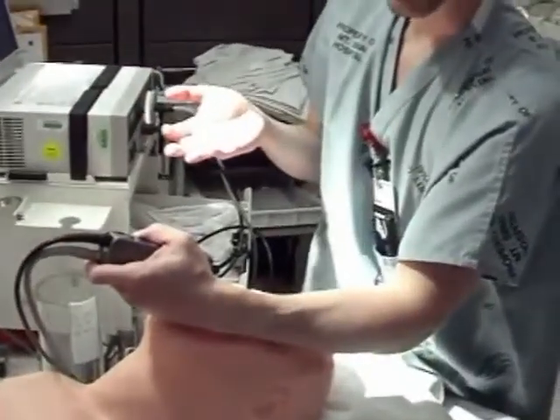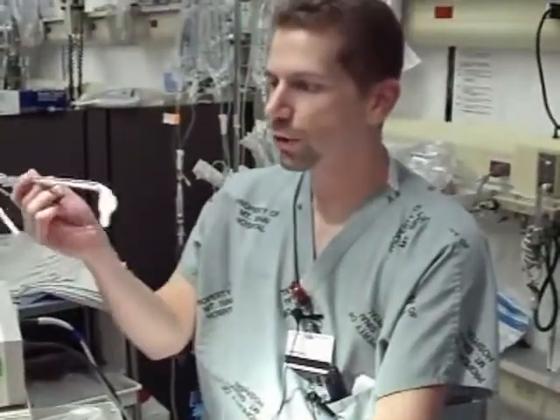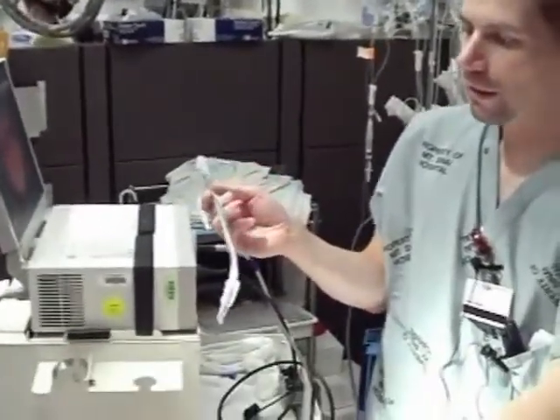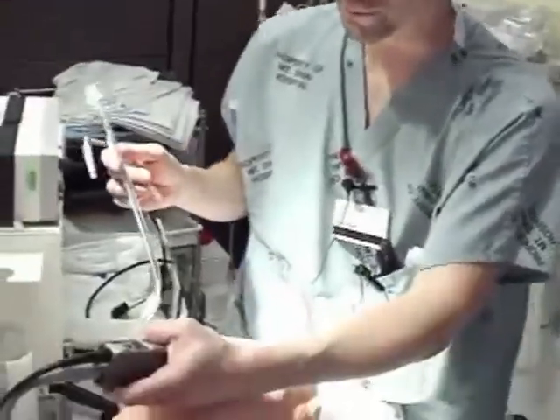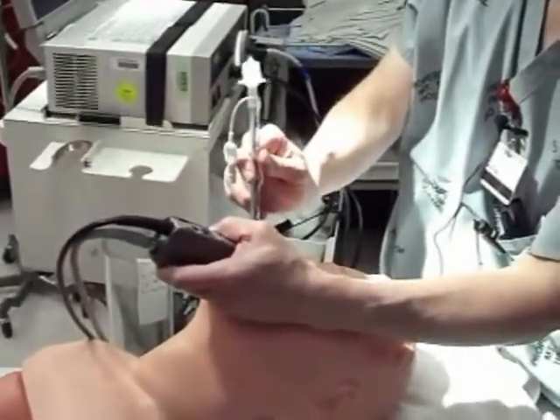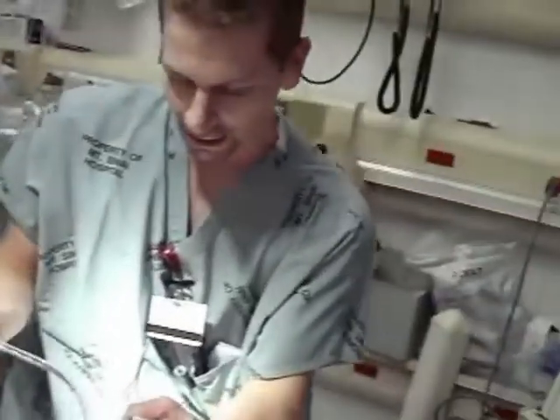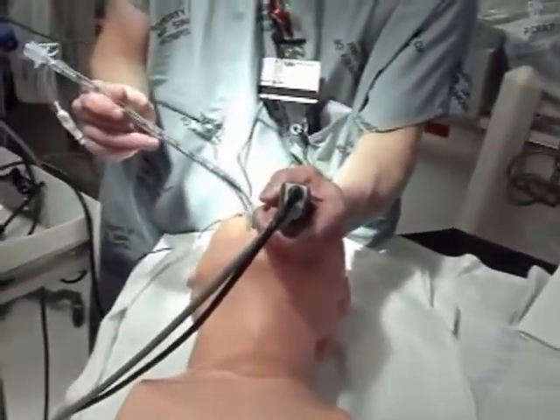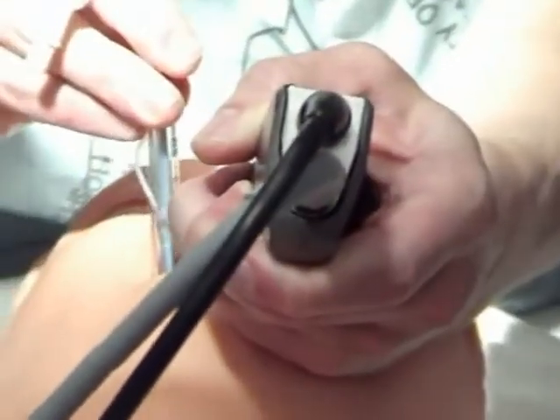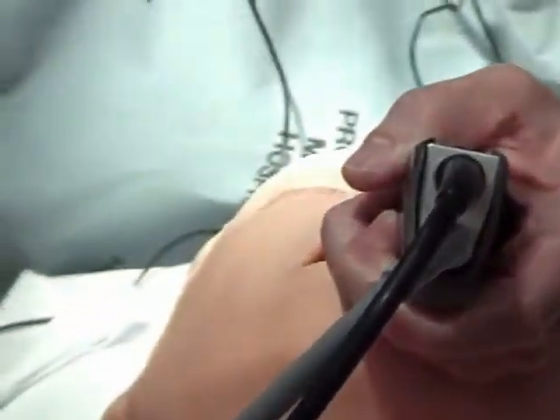The last step is to pass the tube. We have our tube set up straight to cuff — totally straight until the cuff — and then we put a 35-degree bend on. On a real patient, use at least an 8.0 tube unless there's a compelling reason not to; it makes pulmonary toilet a lot easier. Here's a common mistake: people see their cords, get excited, and come in straight down — that cuts your view entirely of the laryngeal orifice. Instead, turn the tube horizontally and come in from the side. Your eyes stay totally on the cords, and nothing obstructs your view until the tube is directly in front of the cords. The motion is horizontal, horizontal, horizontal — only at the last second do you tilt it in and turn.